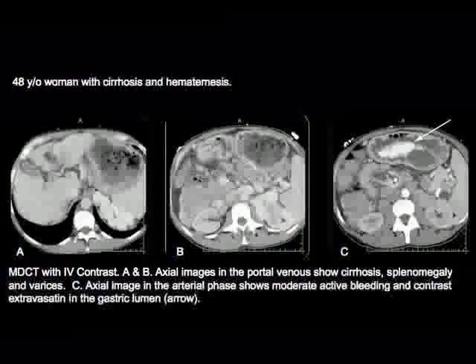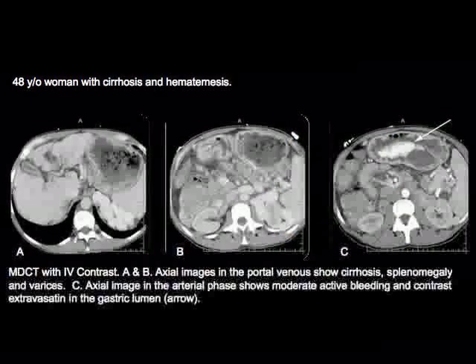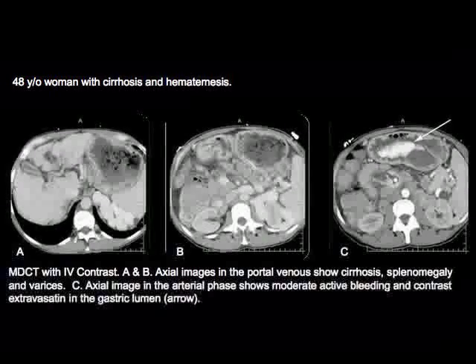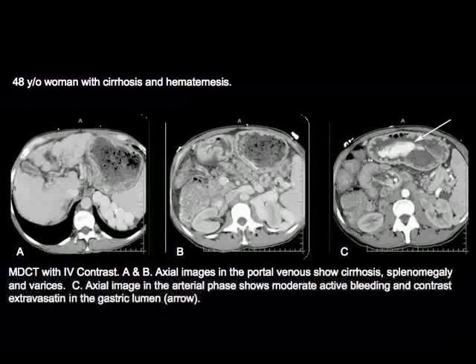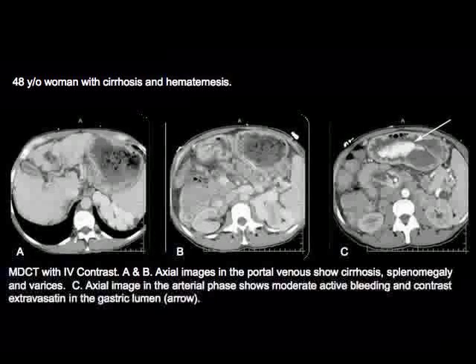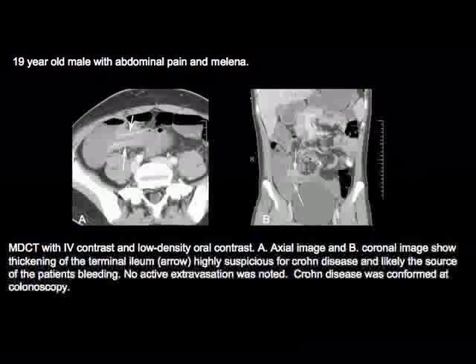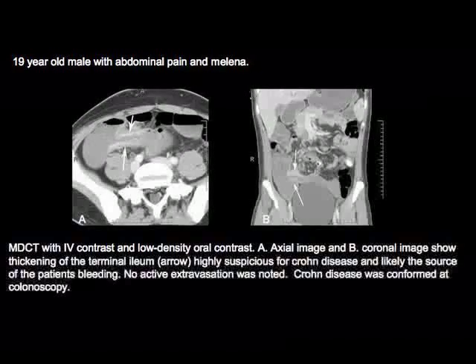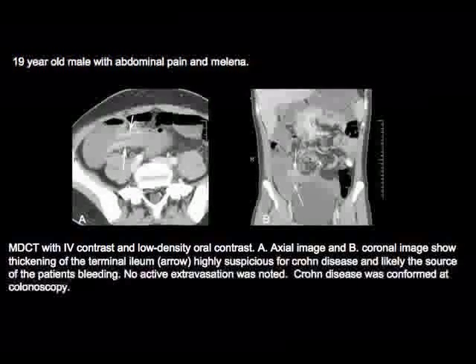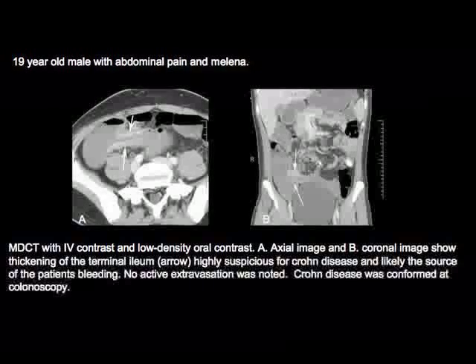This case shows a patient with cirrhosis and hematemesis — look at the stomach: active bleeding with contrast extravasation in the gastric lumen, almost looking like oral contrast, but none was given. Another example: a 19-year-old with abdominal pain and melena shows a thickened terminal ileum with enhancement compatible with Crohn's disease. No contrast extravasation is seen, but Crohn's disease is assumed to be the cause of the bleeding.